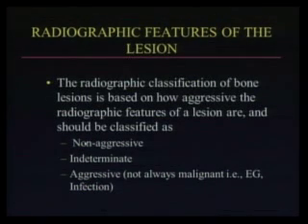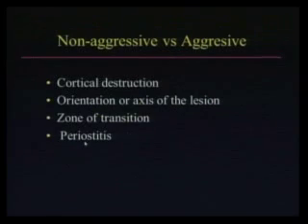Okay, so the first thing that you have to do is decide if the lesion is aggressive or not, to narrow your differential diagnosis. Sometimes it's going to be difficult to say if the lesion is aggressive or not. Aggressive is not synonymous with malignant, right? Because sometimes infection or EG may simulate aggressive lesions.